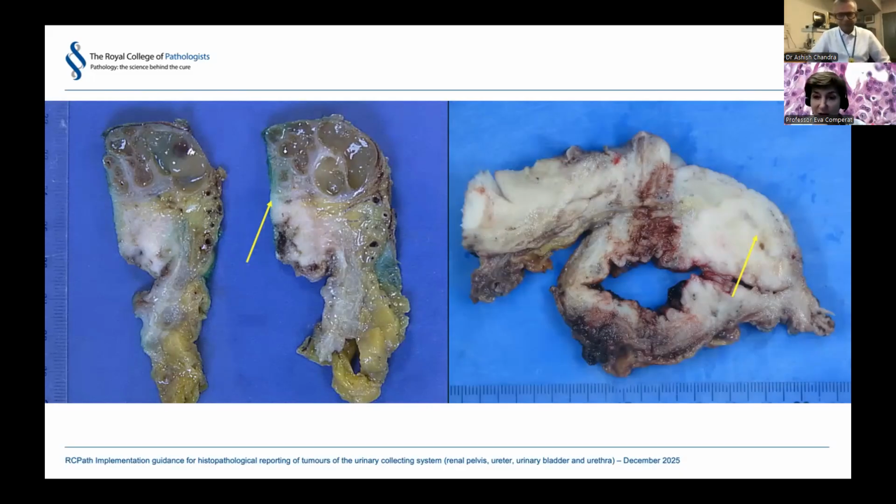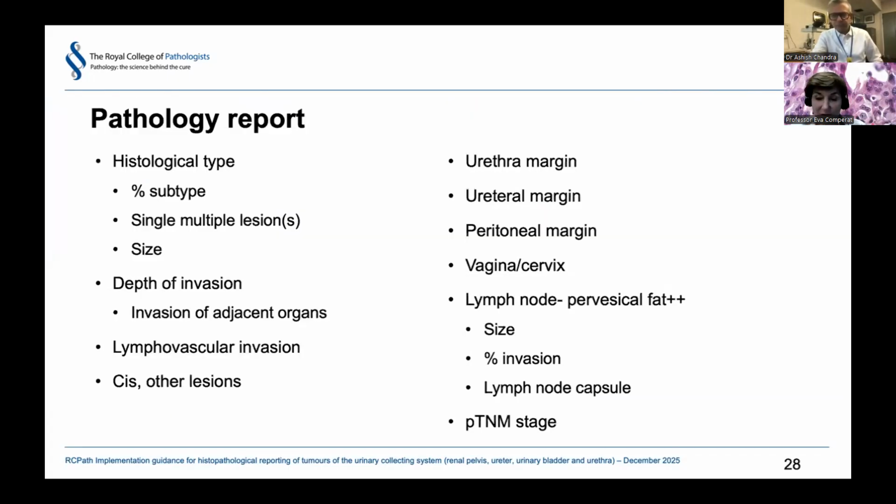And on the right, you have a female bladder once again. And you can see here where it's very close between the bladder and the vagina. You have to be really very, very careful. And this is really the part you have to take. And sometimes I take it even in the big whole mount sections to be sure to have everything.